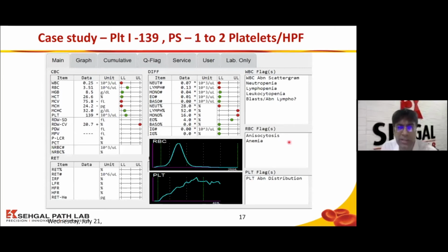So let's look at this machine flag. Here the platelet count is 1,39,000, and the machine gave it as platelet abnormal distribution. Now, two things are very clear to us. Once you look at this graph, the peak is going up, but the peak has not come down. That means the analyzer does not know where to put this second green line or the cutoff, whether to put it here, here, here. And even if you ask 5 doctors, 5 pathologists, 5 technicians, they will give you different places. That means this platelet count is not reliable.